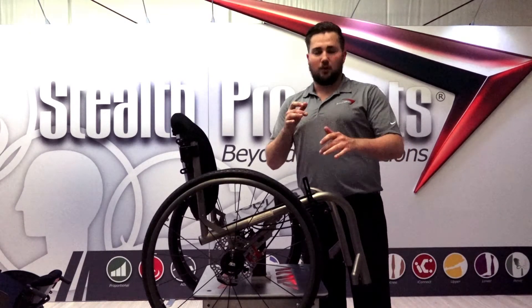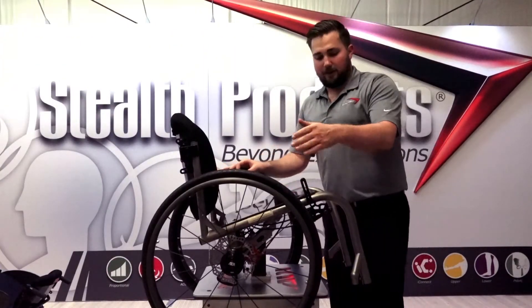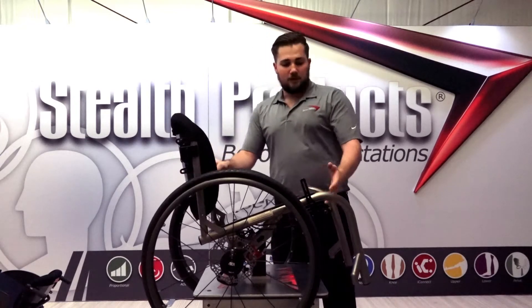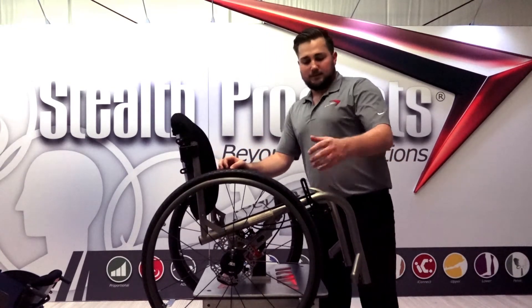What this allows you to do is preset the brakes before taking on different terrains such as hills, ramps, uneven terrain, or even simple applications like sitting at a desk to prevent rolling away while typing. This lever can be mounted on the right side, left side, back cane, rigidizer bar, or even under the frame — whatever matches the accessibility needs of the client.